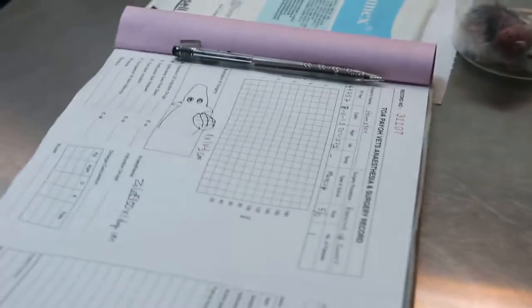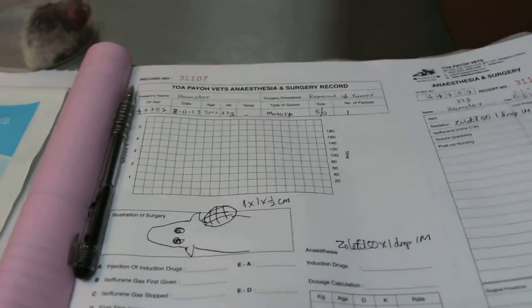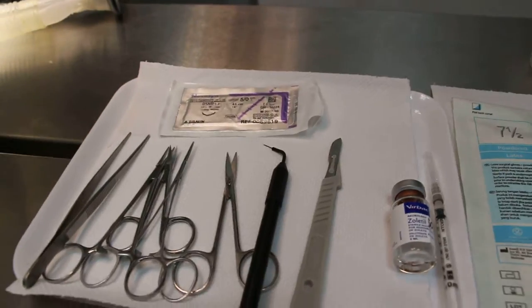This is the surgery and anesthetic records to be recorded. This is the mask and these are the instruments.